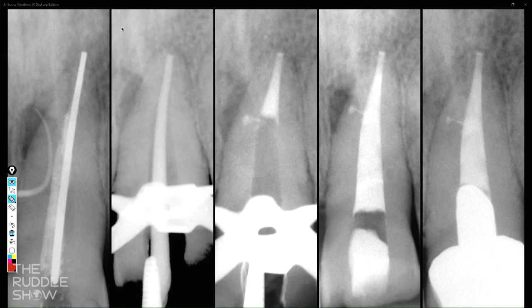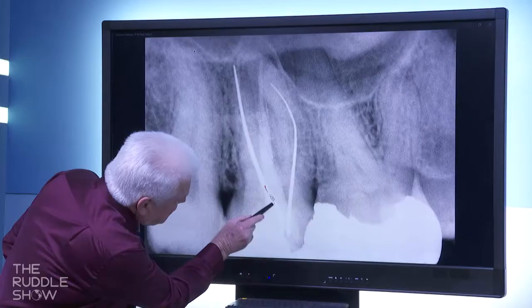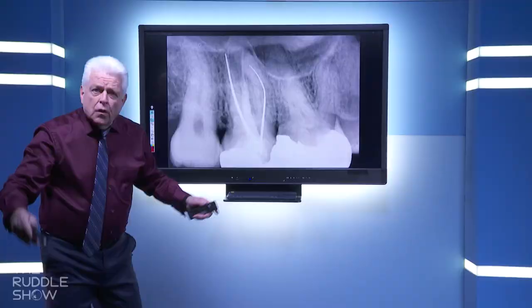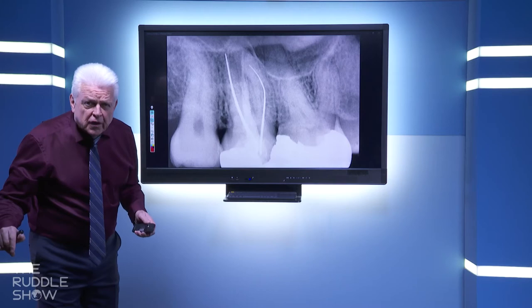So real quick, we can finish up. I'm just coming back to some cautionary notes. You see these silver points, they're not so easy to see, but maybe you see this one in here, maybe you kind of see this one in here. So when you're tunneling back in, be careful, brush in mesial to distal, buccal to lingual as you progressively work towards the pulp chamber. You'll see maybe a little shiny silver dot. Stop, get out your ultrasonic unit, start blowing out that buildup. The short one is the MB.